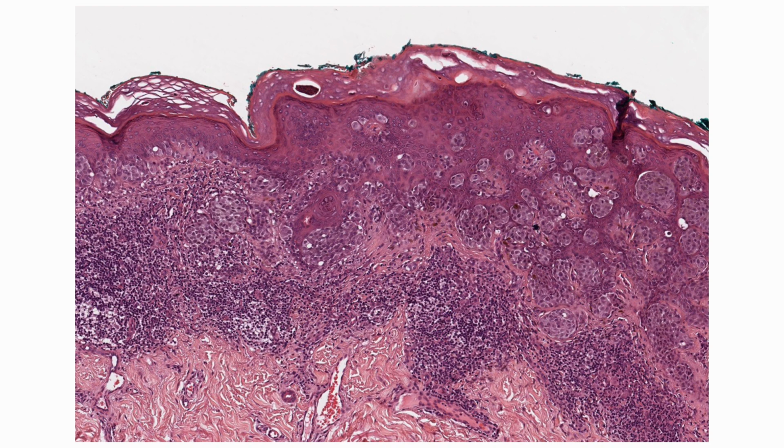You can also see lymphocytes attacking those melanocytes. Some people describe those lymphocytes as smart bombs. They are trying to target those malignant melanocytes and kill them. So that is the very typical picture of a melanoma.